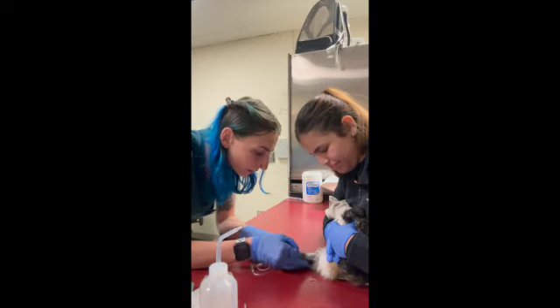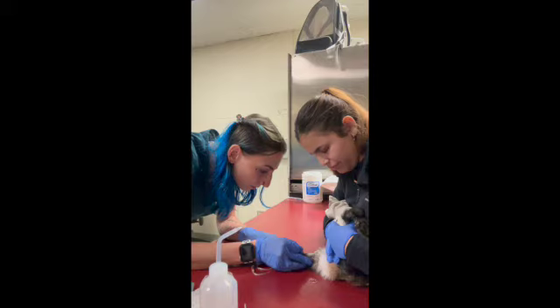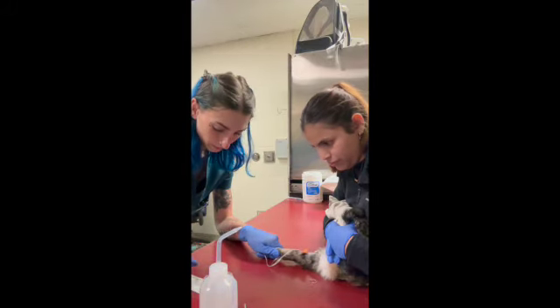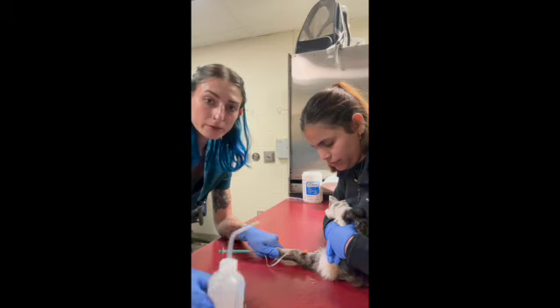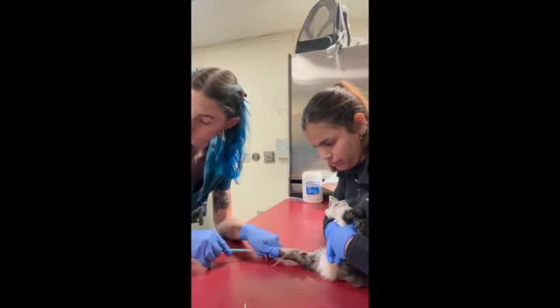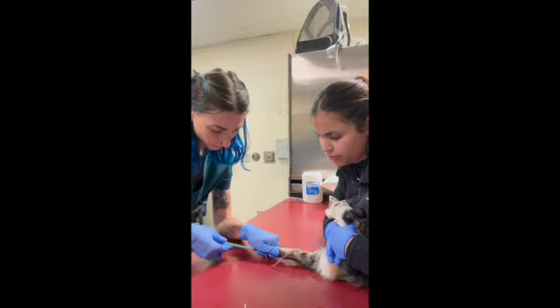Cut that in my video. Alright, and okay. Alright, so I have blood in my line, so now I'm just going to start pulling. And I'm done.